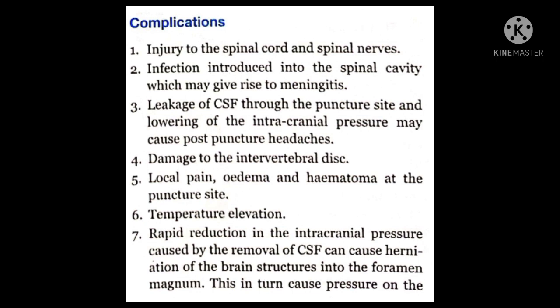complications. 1. Injury to the spinal cord and spinal nerves. 2. Infection introduced into the spinal cavity which may give rise to meningitis. 3. Leakage of CSF through the puncture site and lowering of the intracranial pressure may cause post-puncture headaches. 4. Damage to the intervertebral disc. 5. Local pain, edema and hematoma at the puncture site.